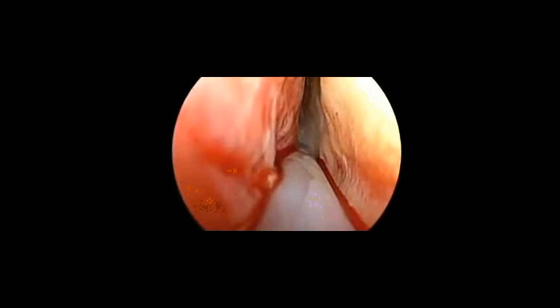The right side is done in a similar fashion. The turbinate is gently outfractured. The 0-degree guide catheter is put in position. The light probe is now advanced to try to cannulate the ostium. We can see the light is behind the wall, indicating it's in the sphenoid sinus.